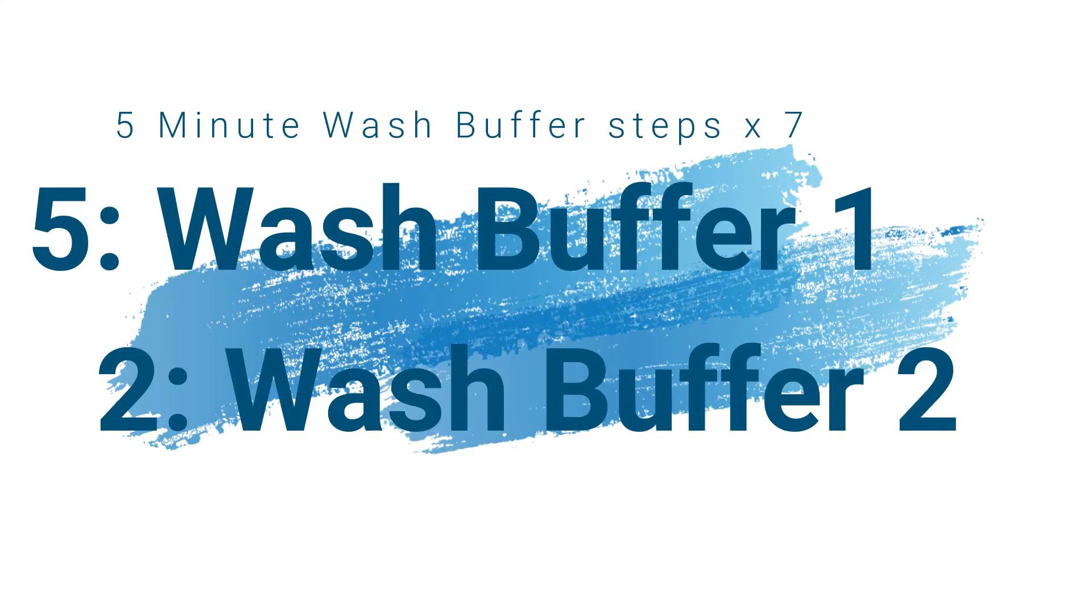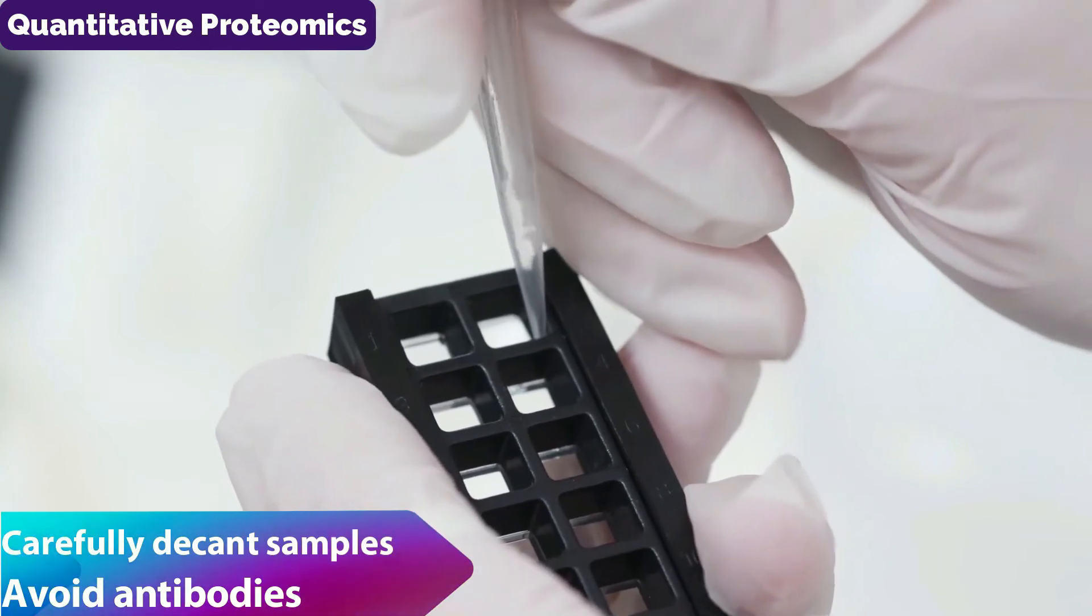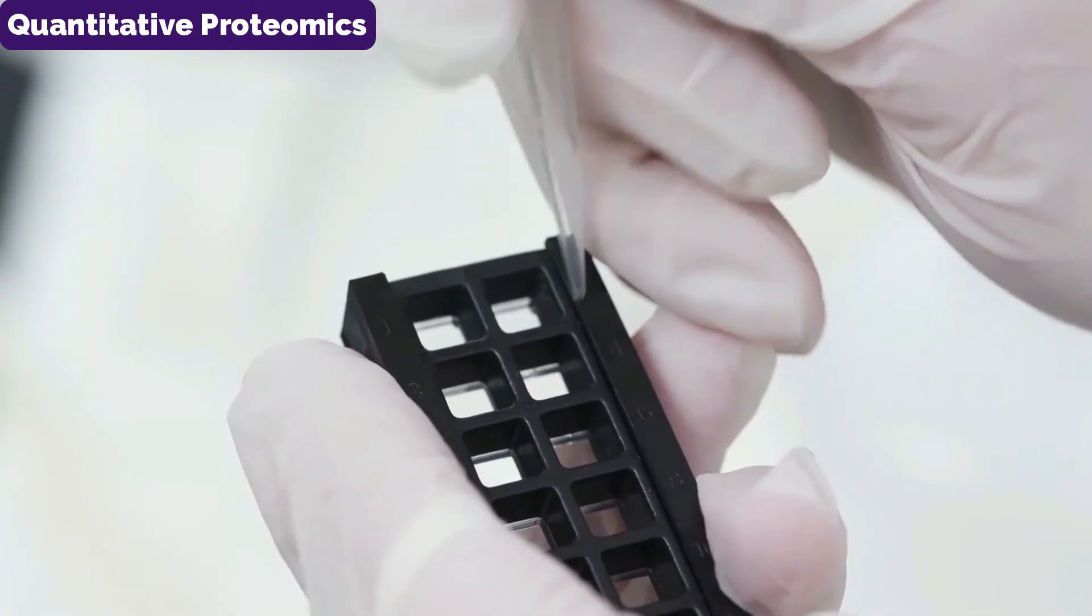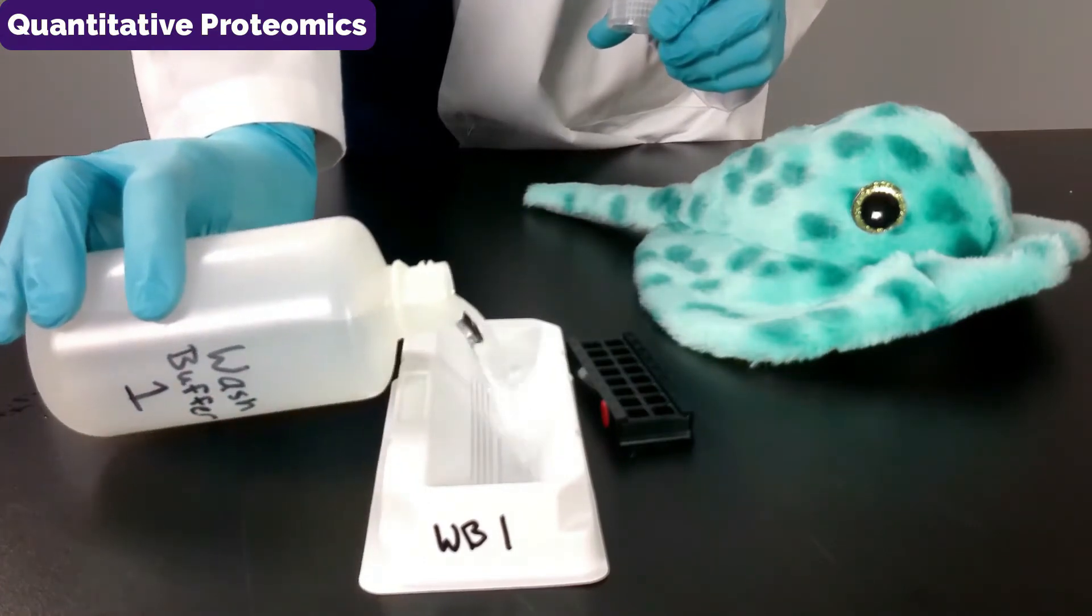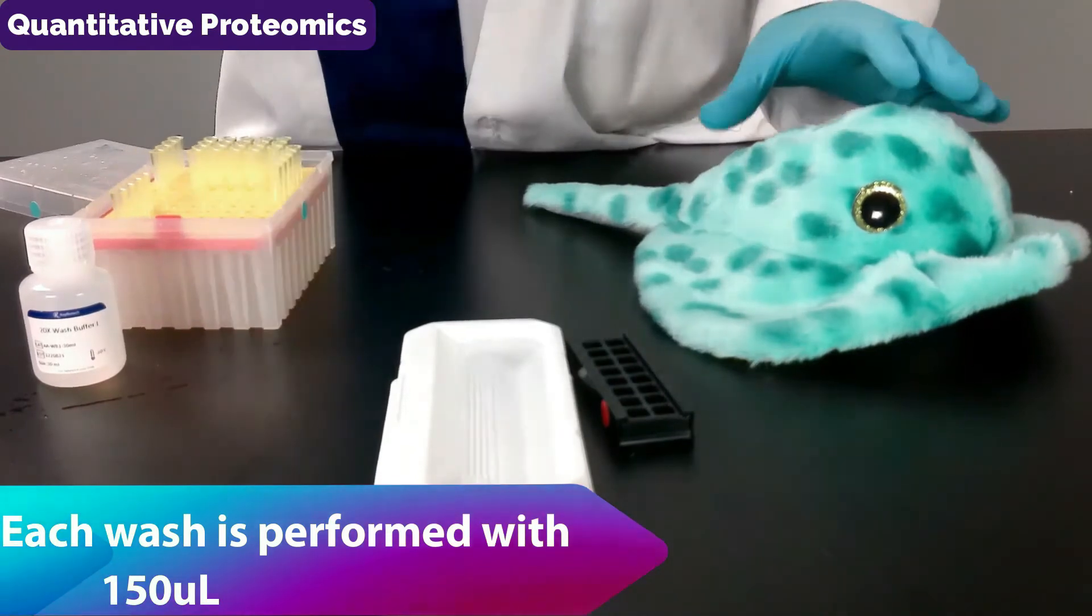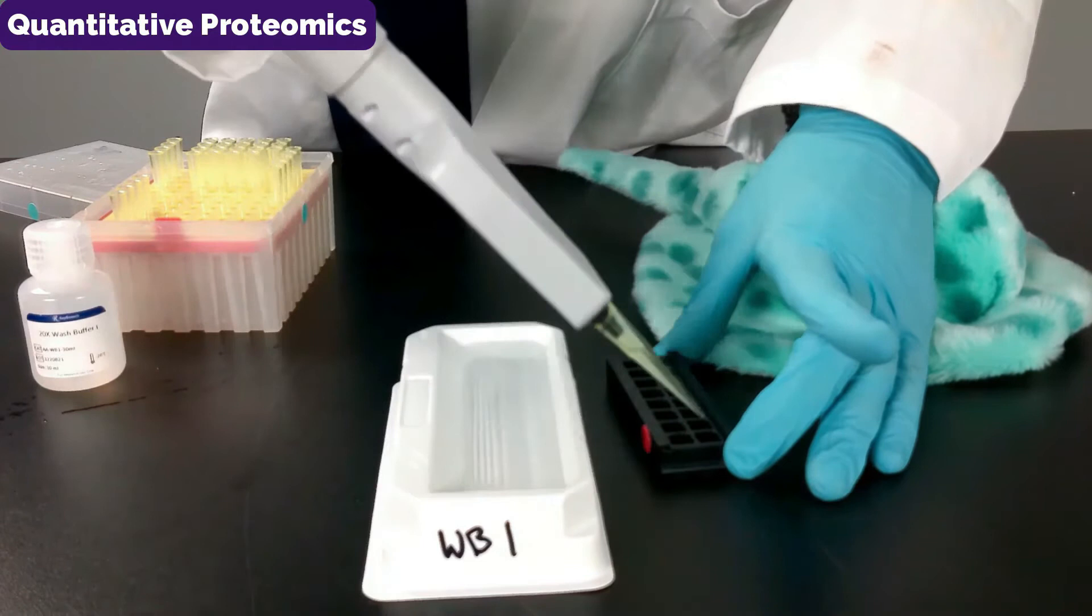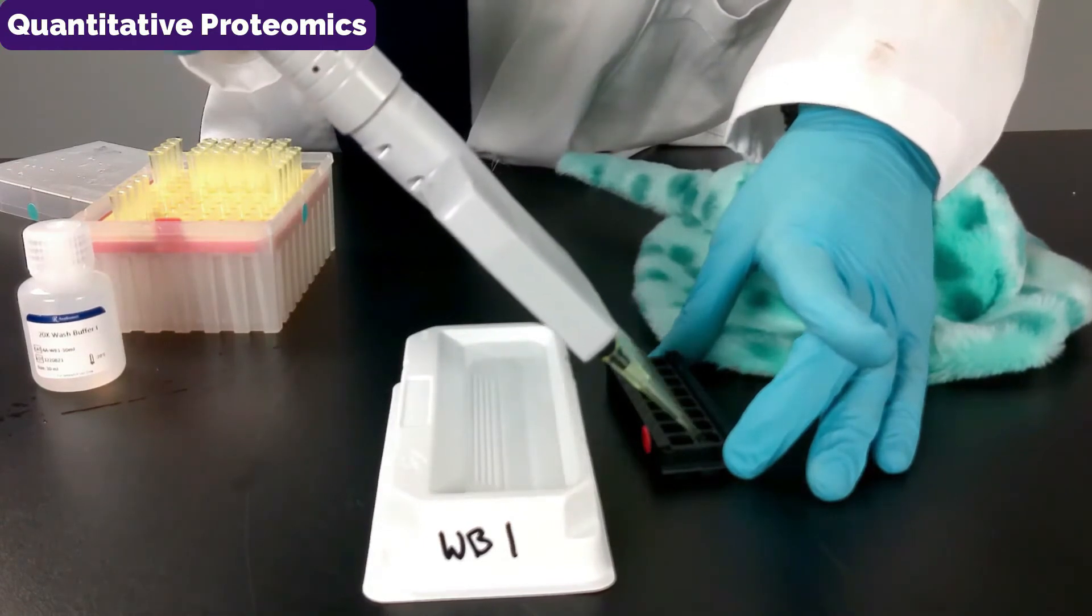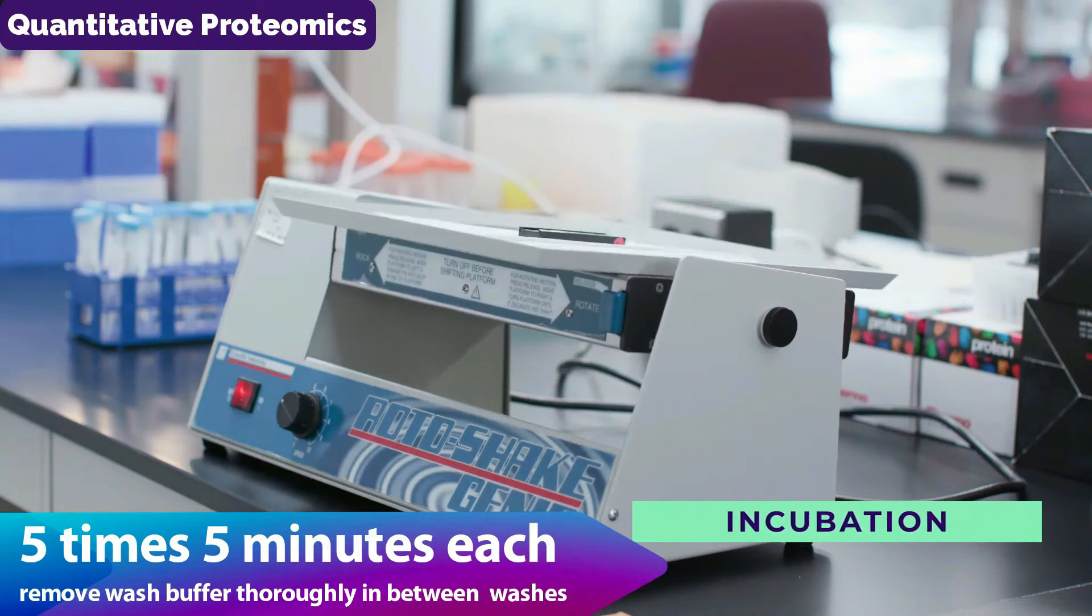In between each incubation, you will do seven wash steps. First, carefully decant the sample diluent. Add wash buffer to the tray and then pipette with the multi-channel 150 microliters onto the slide. You'll then incubate for five minutes and repeat this process five times. Remember it is important to remove the wash buffer thoroughly in between washes.